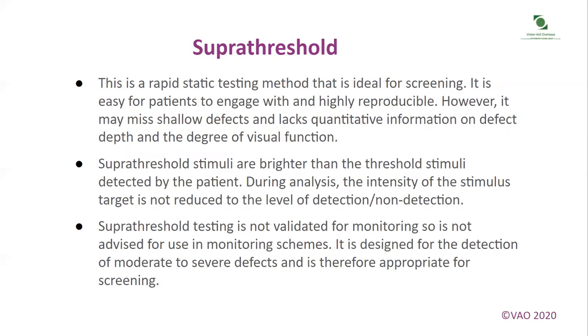Suprathreshold. This is a rapid static testing method that is ideal for screening. It is easy for patients to engage with and highly reproducible. However, it may miss shallow defects and lacks quantitative information on defect depth and the degree of visual function.